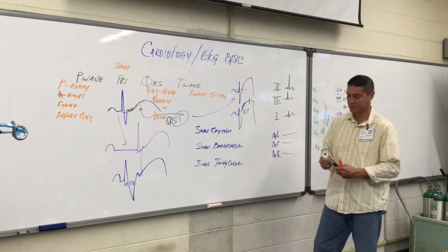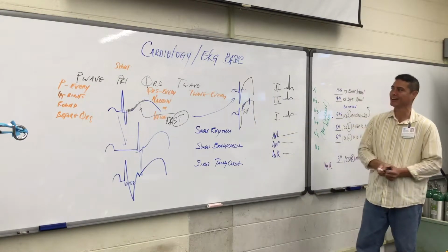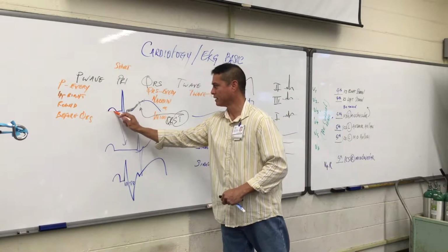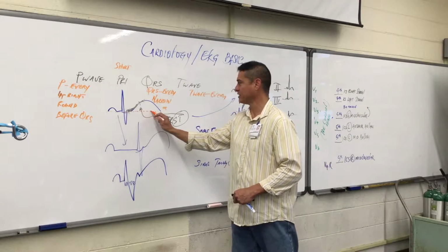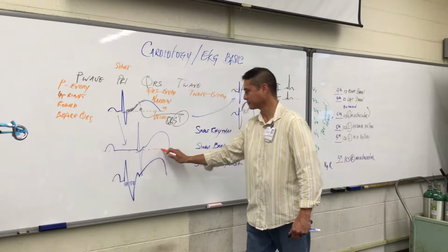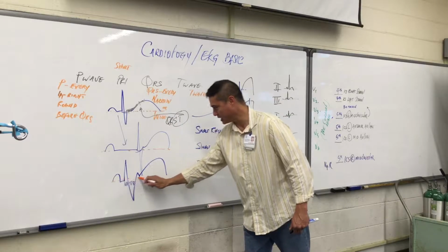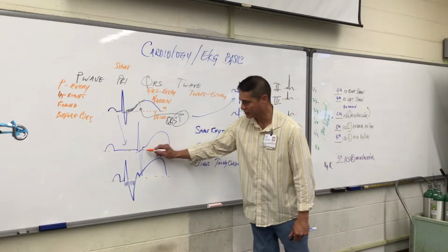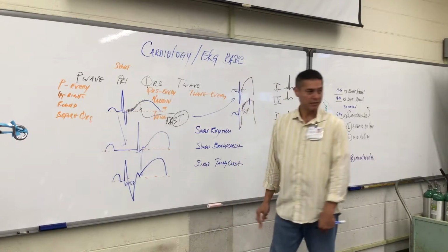Where's baseline again, Dave? Well, it was that imaginary line that I told you you would draw, where the P wave would go across, QRS and T wave went across. So you would draw this imaginary line across your EKGs that you're looking at, and you would ask, do I have an ST segment elevation? Well, that doesn't look that significant.